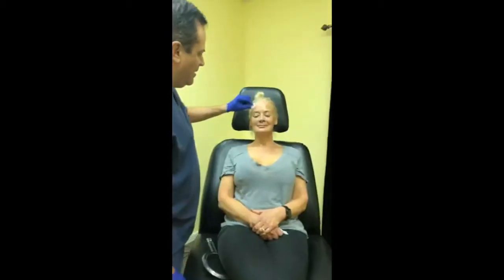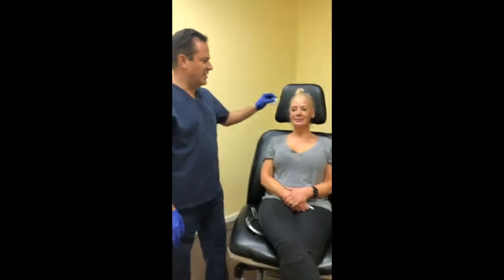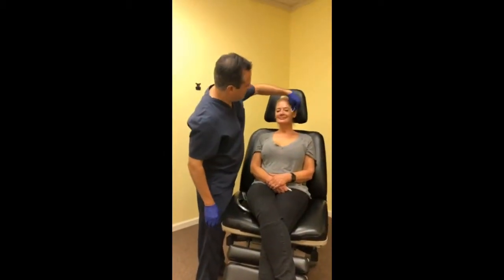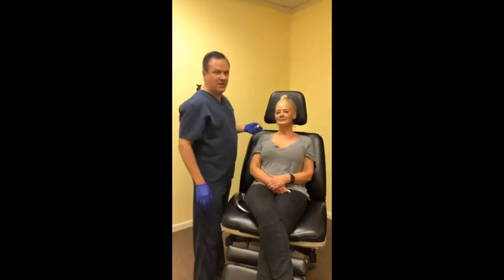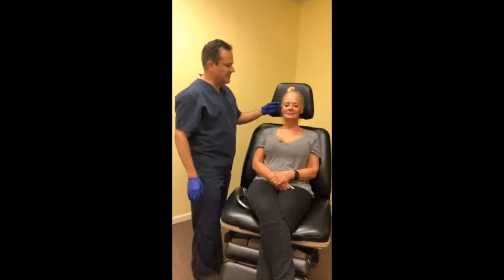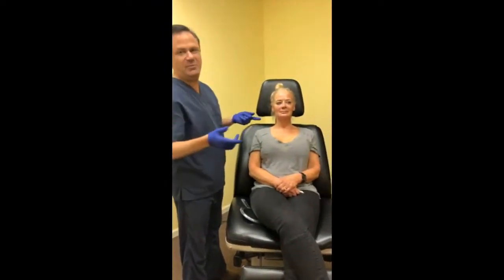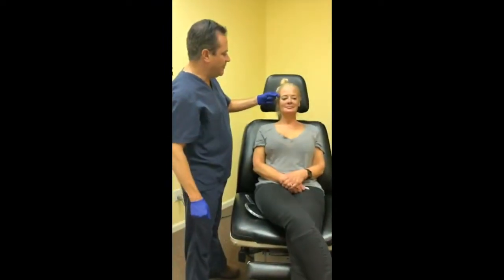Happy Friday guys, we're here live at Robert Schwartz Plastic Surgery getting ready to do some Belafill. This is Tanya, a longtime friend, and we're going to do several things on her today. We've already assessed her, gotten her numb, and done all the prep work already.